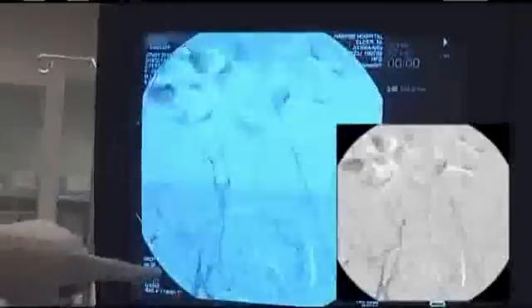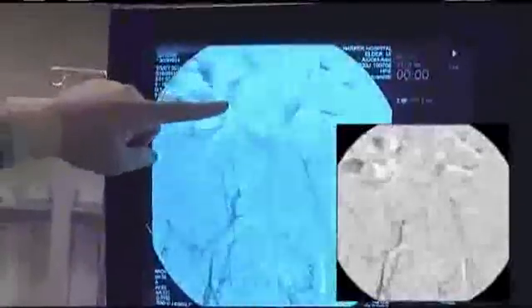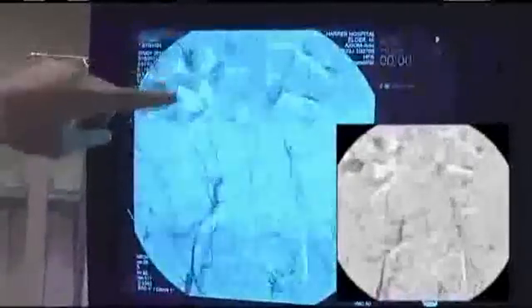And it's quite obvious now, we do have the chronic total occlusion, and so we have our access 6 French on the right and in the left. We have our opaque markers positioning us. We know that there's a moderate to severe lesion inside the left common iliac, and so we're going to begin by pre-dilating the chronic total occlusion.